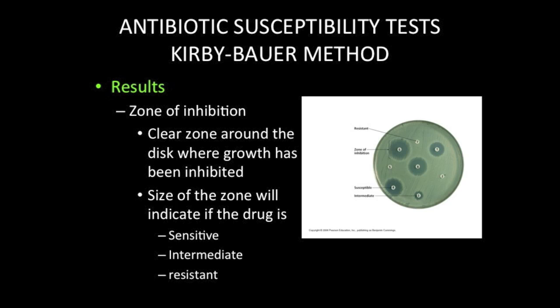So we can see here that the goal of the susceptibility test is to detect possible resistance to an antibiotic. The diffusion susceptibility test is an important tool that aids medical professionals in the selection of an antimicrobial agent that effectively treats a patient's infection. Other tests would follow the susceptibility test to determine appropriate therapeutic doses. We will discuss some of these in Unit 4 of the lecture component.